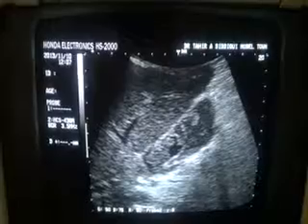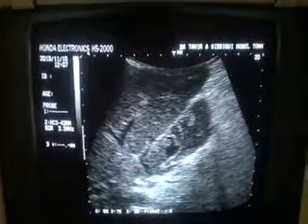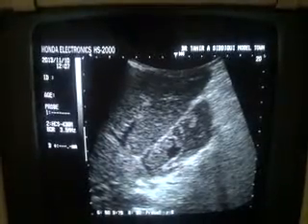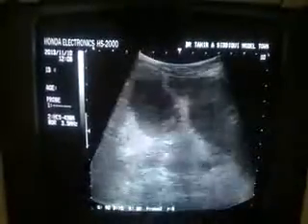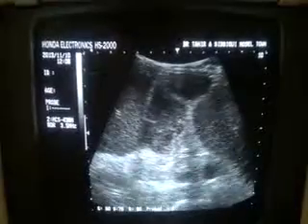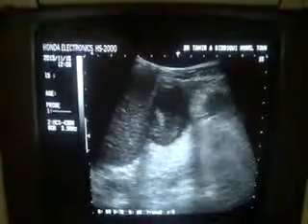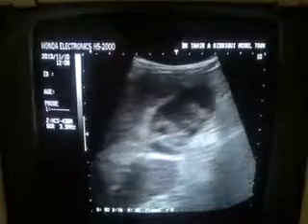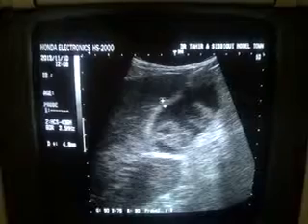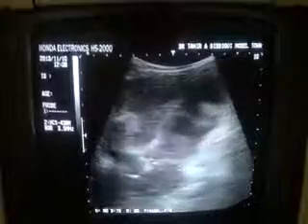Here again, the fundus, the anterior wall, and a small amount of bile is seen. This is the portal vein. This is the gallbladder in transverse section. Its outer wall is irregular and thick — it measures approximately 4.2 millimeters, and more than 4 is considered to be definitely abnormal.